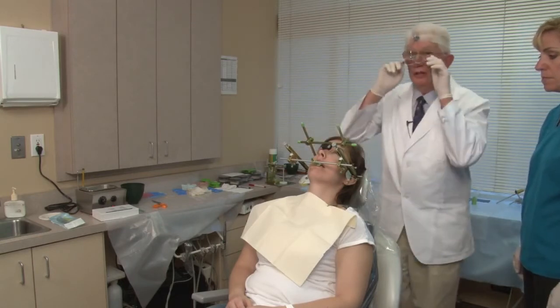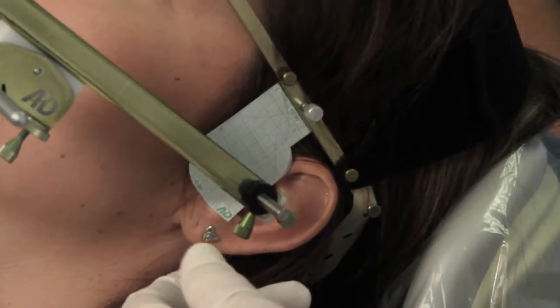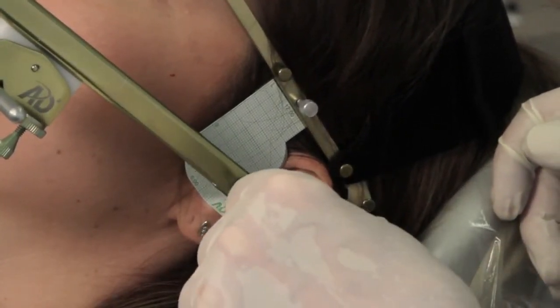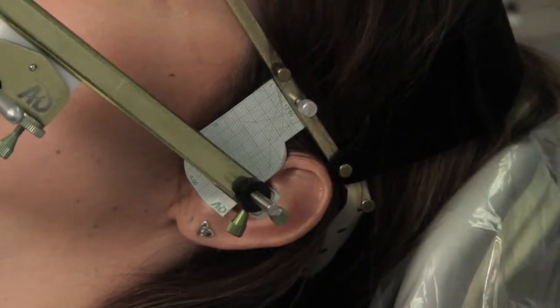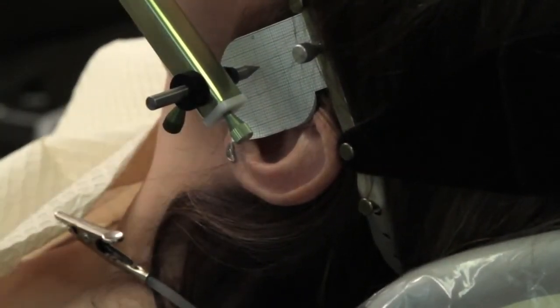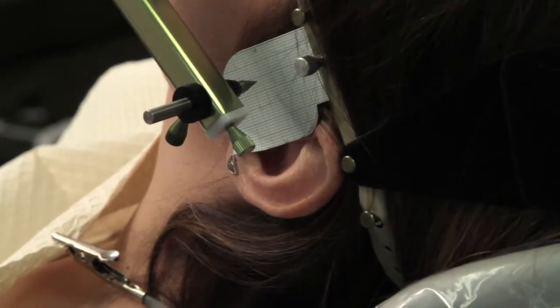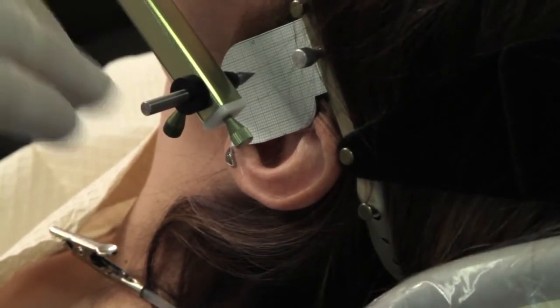Okay, I'm just kind of looking at symmetry. It looks fairly symmetrical. I'm going to start on the left side to illustrate how you locate an axis. To do this, I want the stylus pen loose, and I want it to be able to touch the flag. I want to be able to have it move in and touch the flag. Okay, I want to illustrate how you locate an axis. When the patient will open and close, the stylus pen will move, and it'll form an arc of a circle. And so what we're trying to do is find the center of that circle.